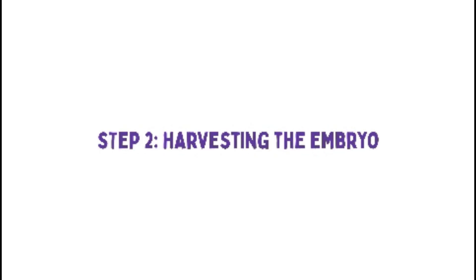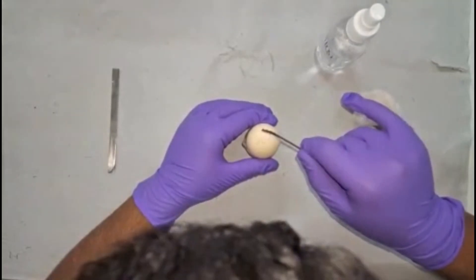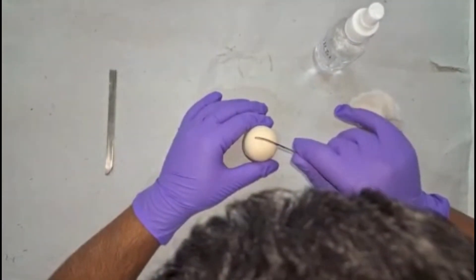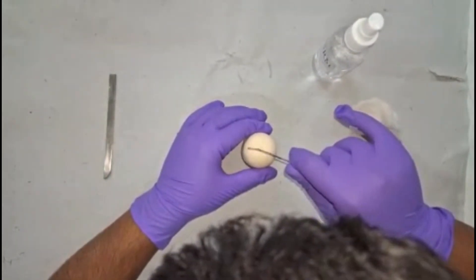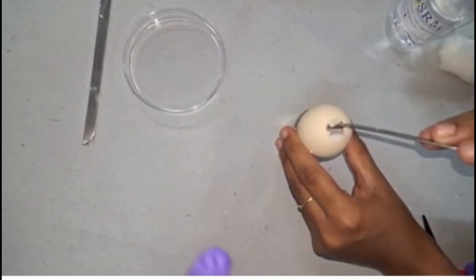Step 2: Harvesting the Embryo. Use a sterile scalpel to carefully open the fertilized chick egg at 10 to 12 days of incubation. Gently remove the embryo using forceps and place it in a petri dish containing PBS to wash off excess yolk.